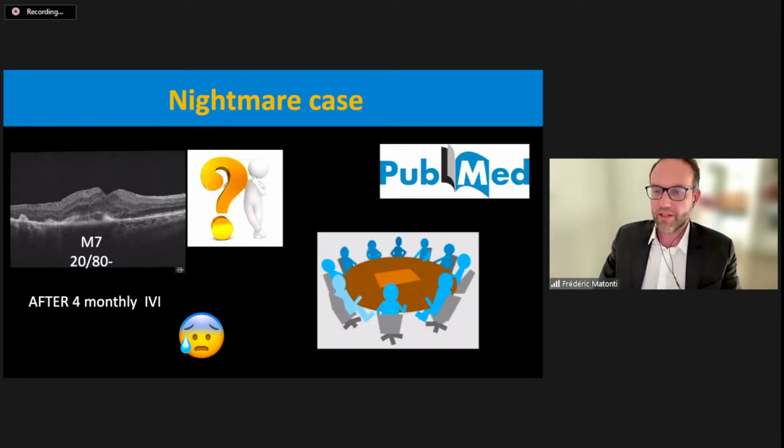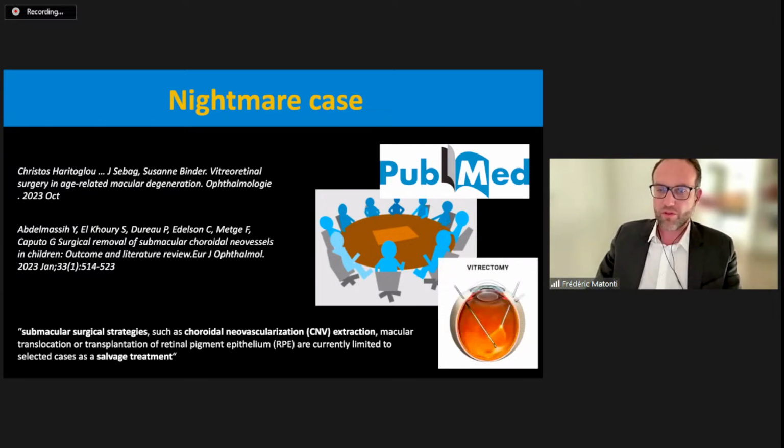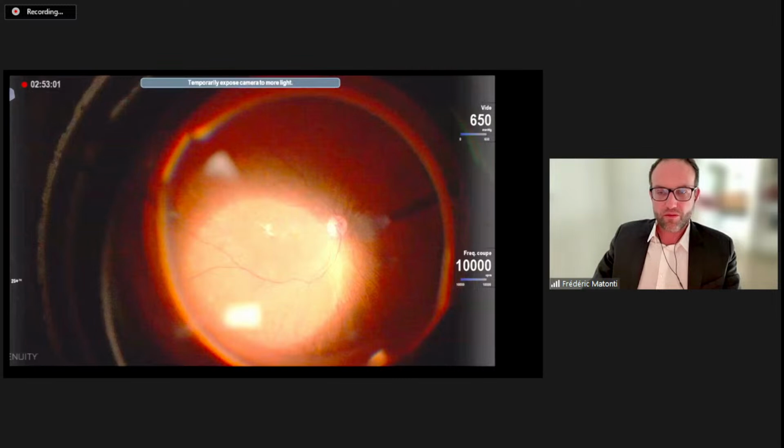So I discussed with some of my colleagues, and specifically with someone with huge skills in terms of retinal surgery for neovascularization before the era of anti-VEGF. And I found in some recent publications, in October and January 2023, on the place of subretinal surgery. It's sure it's not a first-line treatment, but in complex cases, as in traumatic neovascularization, inflammatory neovascularization, we don't have a choice because, as you see, the anti-VEGF are not effective on this kind of membrane. So I decided to operate on the patient.